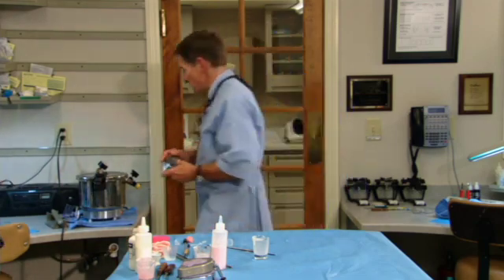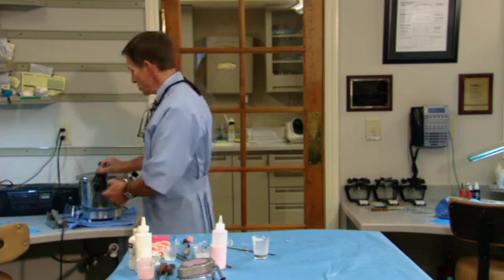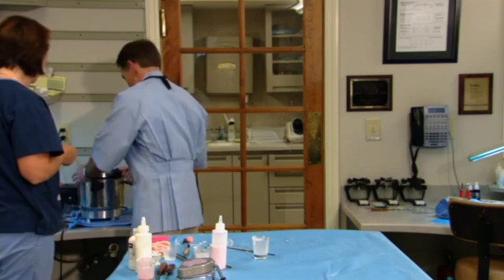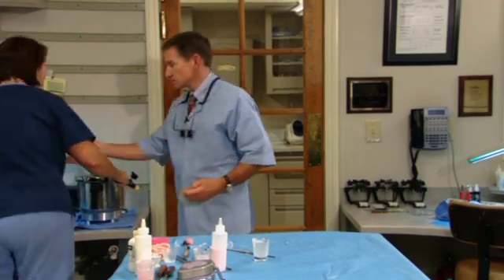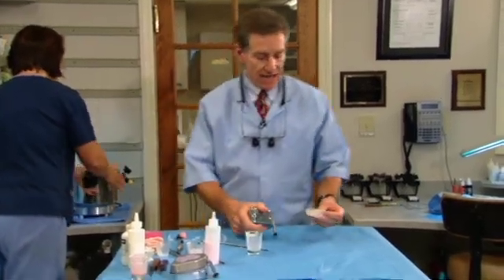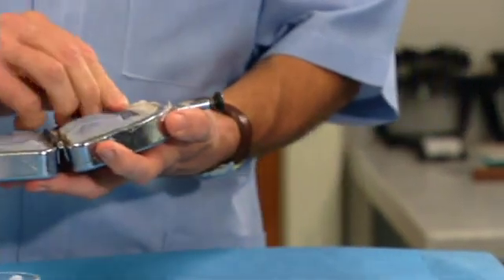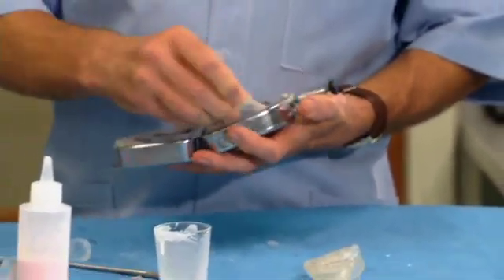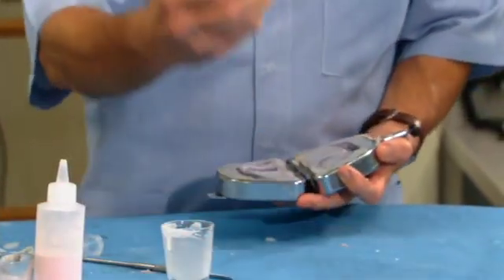Kathy, could you hand me Miss Patel's clear duplicate? I'm going to drop this in the pressure pot. I'm going to show you a clear duplicate. You got her jig too. This is a patient that we had approved provisional denture. This is her jig, and we made her denture and we used hydrocast. You can see the hydrocast is still stuck on here a little bit. Here is her clear duplicate.